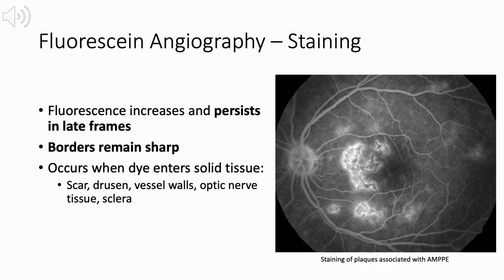The accompanying angiographic image illustrates this pattern. The image shows late staining of plaques associated with acute multifocal posterior placoid pigment epitheliopathy, demonstrating persistent hyperfluorescence with sharply demarcated borders, consistent with staining rather than leakage.